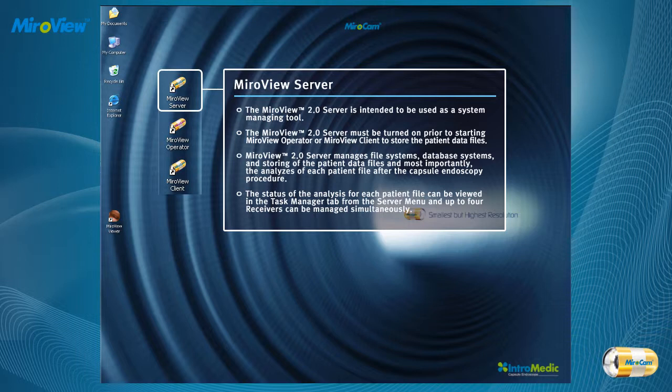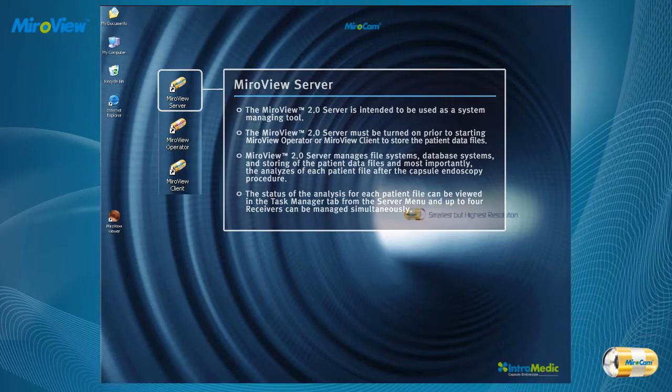MiroView 2.0 Server manages file systems, database systems, and the storing of patient data files, and most importantly the analysis of each patient file after the capsule endoscopy procedure. The status of the analysis for each patient file can be viewed in the Task Manager tab from the Server menu, and up to four receivers can be managed simultaneously.